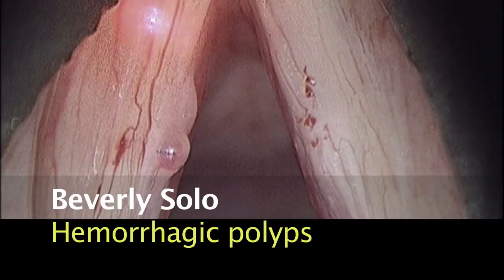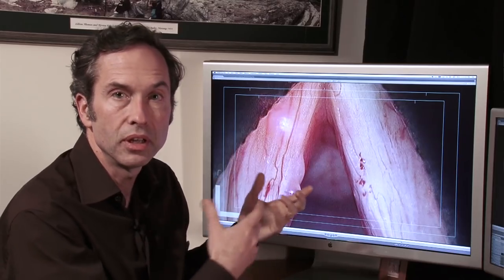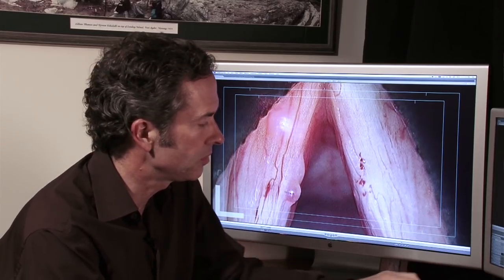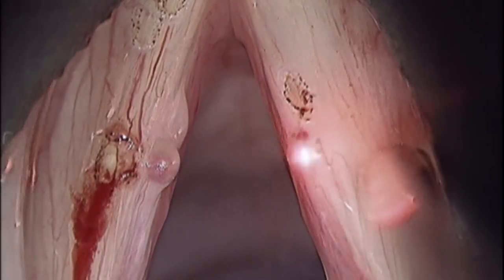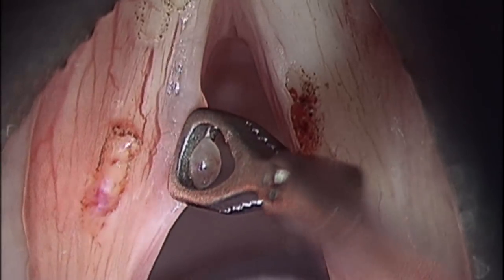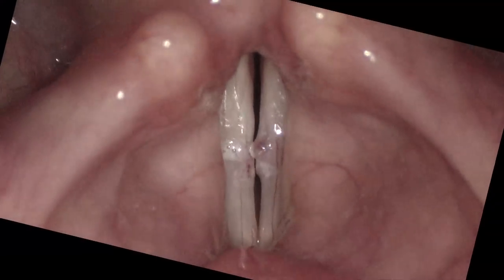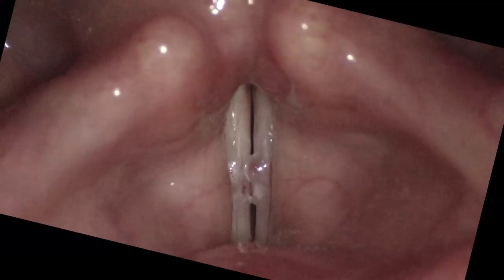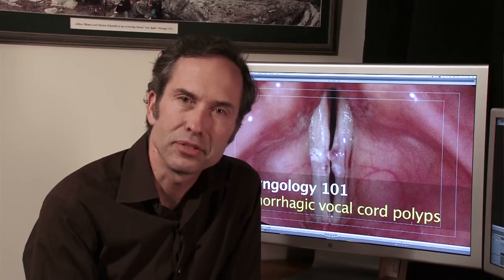Let's take a look at one last case. We have a number of hemorrhagic polyps, a capillary lake, and several dilated capillaries — there have been a number of vocal injuries here. In summary, we can go through with a laser to get rid of these various capillary lakes, pull the polyp as far medially as we can and cut it off with whatever technique we want, and go from a very rough voice to a set of flexible vocal cords that are very supple. I'm Dr. James Thomas with VoiceDoctor.net. Thank you for listening.